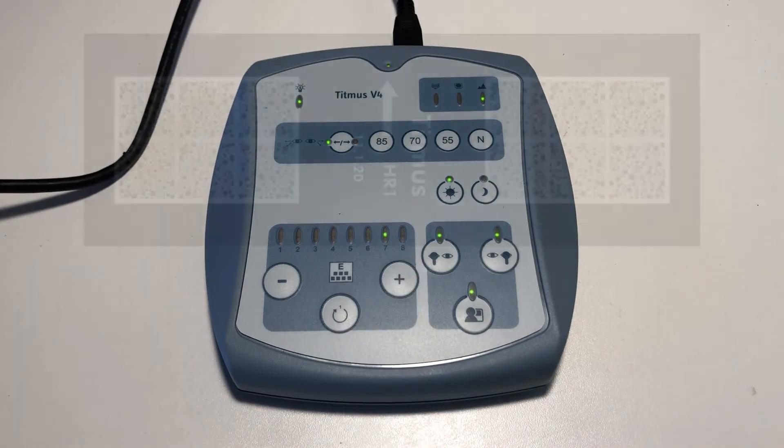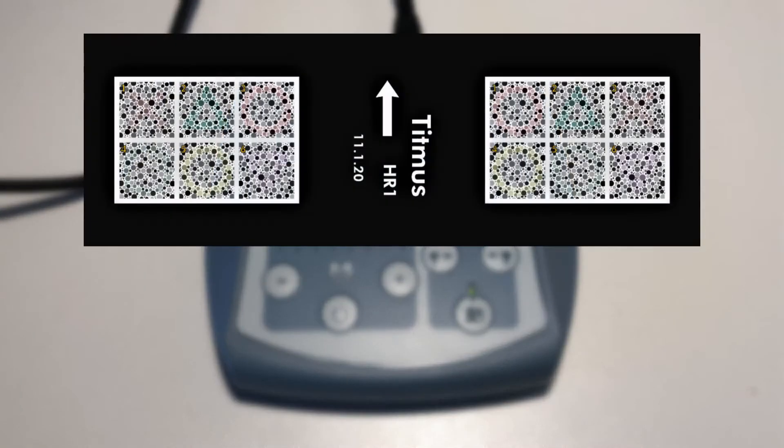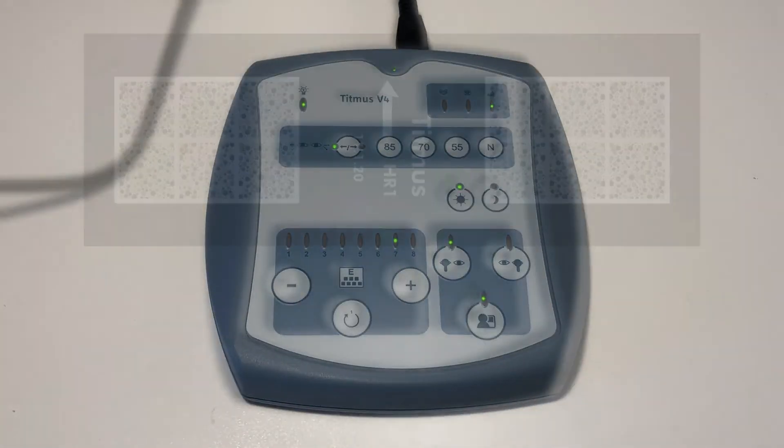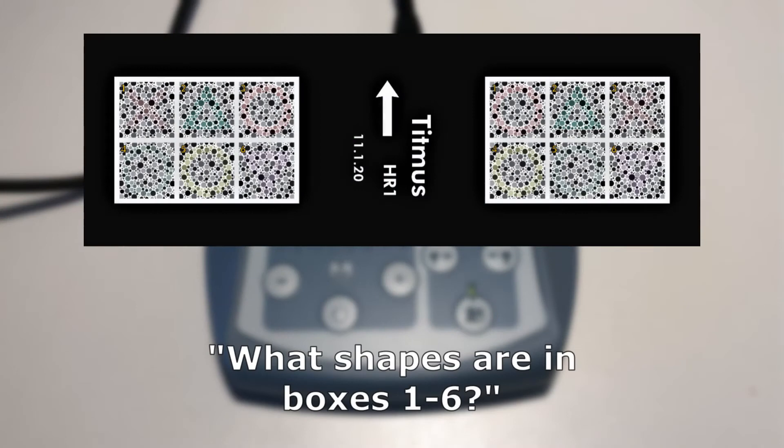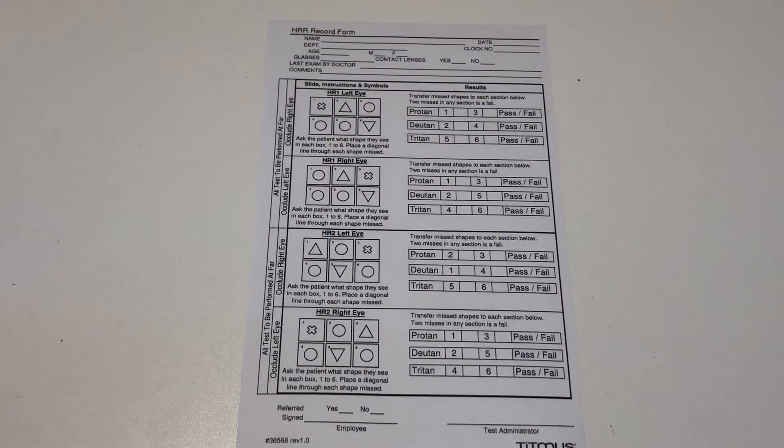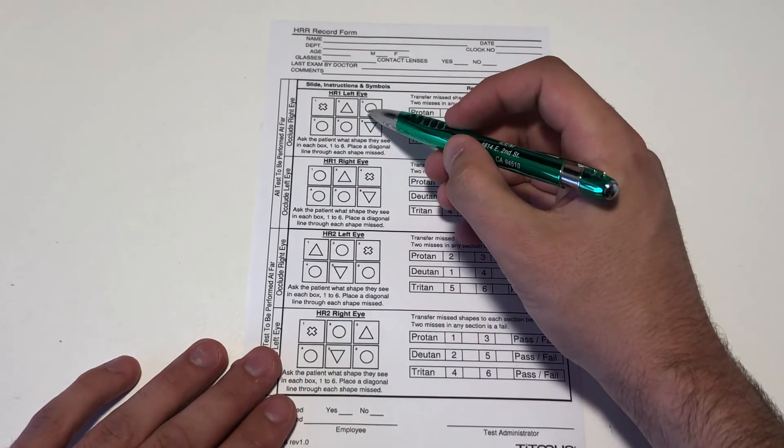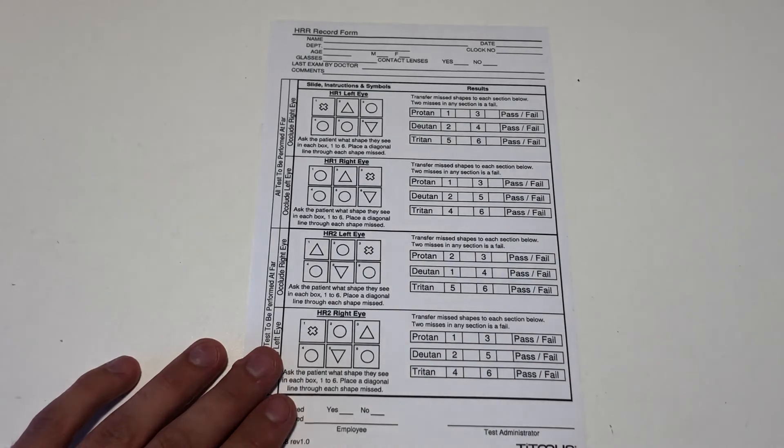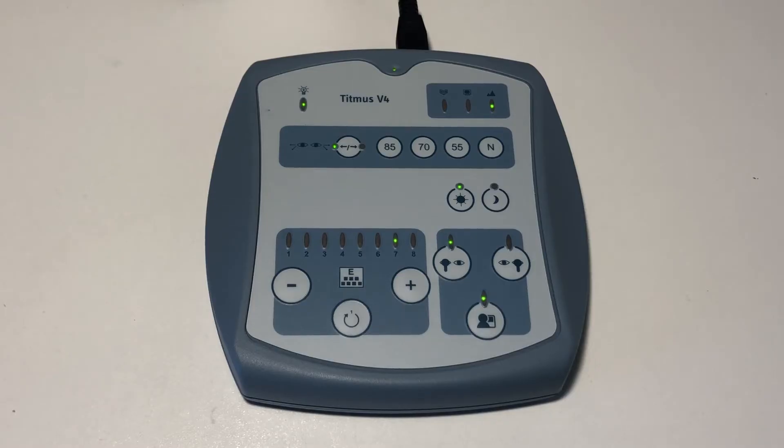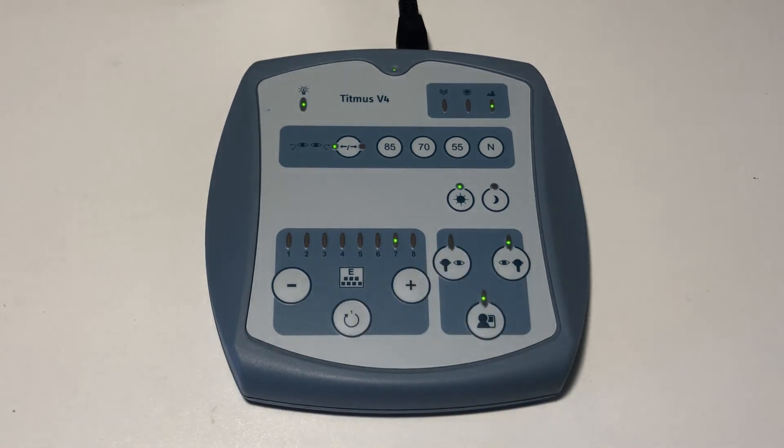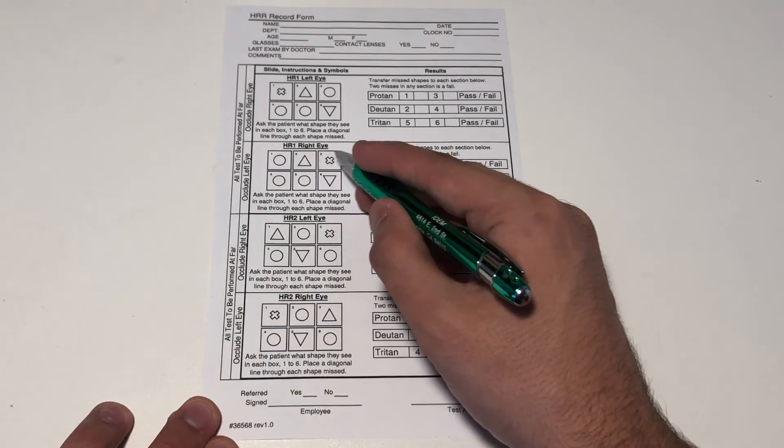Advance the slide to number seven. This slide tests for more specific types of color perception issues. Occlude the right eye. Ask the patient, when you look at the slide, what shape is in box number one, number two, and so on to number six. Record the results on the record form under HR1 left eye by crossing out each incorrectly identified shape. Now occlude the left eye and repeat the procedure. Record the results under HR1 right eye.